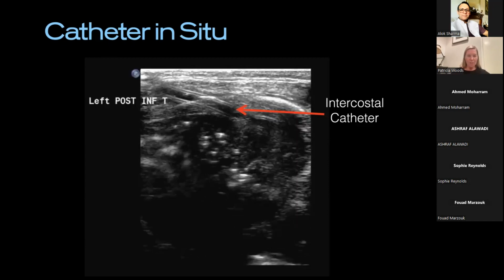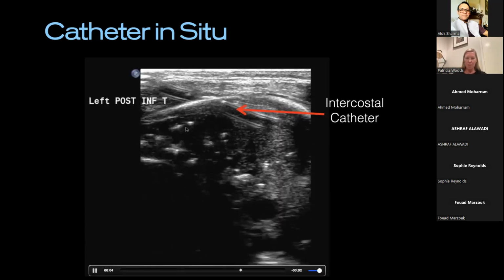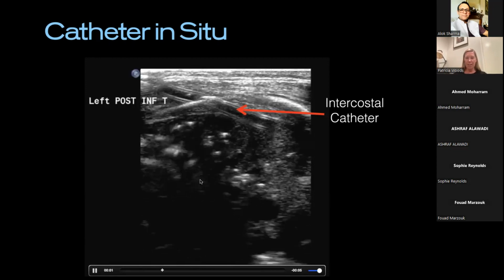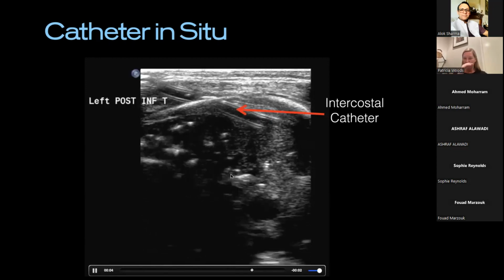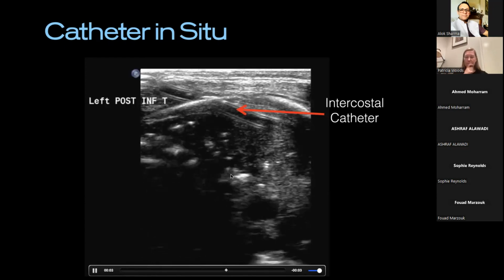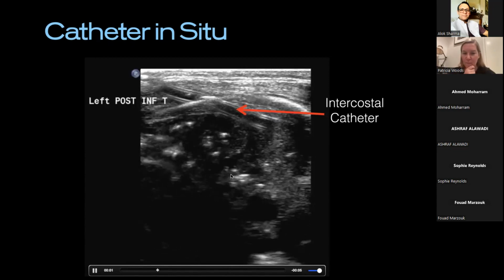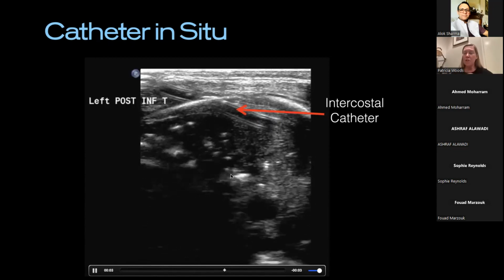When I'm looking at this really carefully, I think what I can observe here within this lung, can anyone name this sort of sign? I know we've got hepatization, but I'm just looking here, you've got this sort of bobbing nature. There is a term for that. Shred sign, I think. Say again? The shred sign. You've got a shred sign for sure.